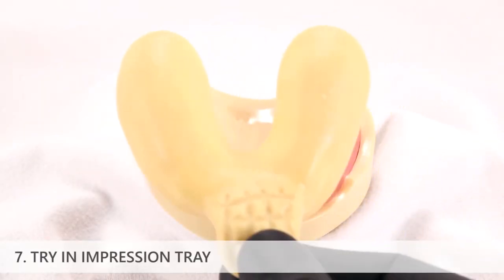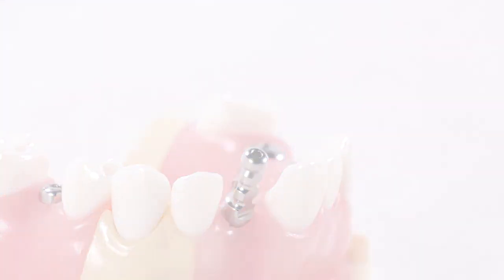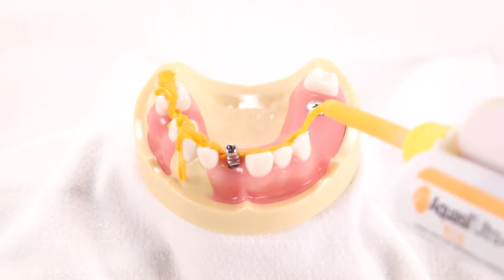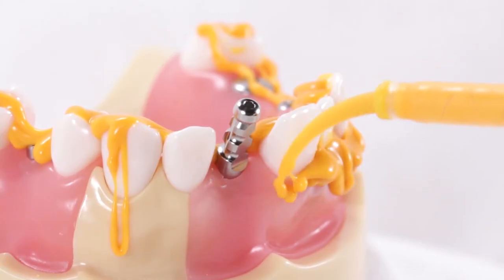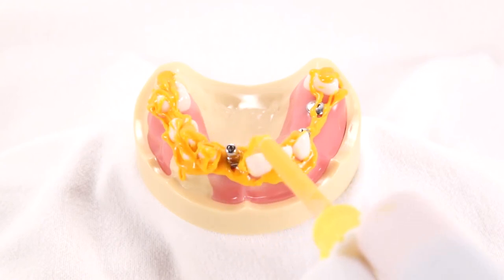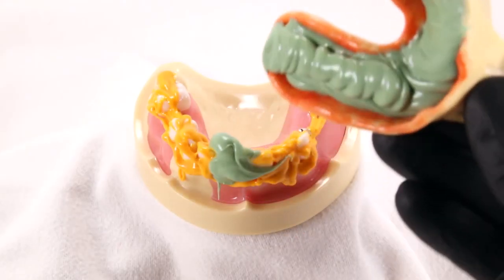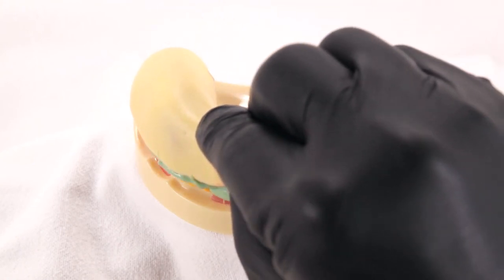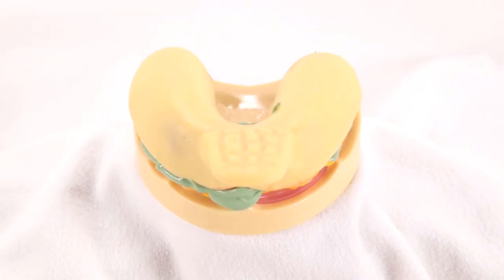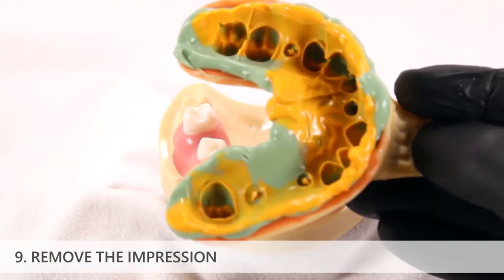Try in the customized impression tray or a rigid stock tray and verify appropriate fit before proceeding. To make the impression, first syringe lightbody impression material on the occlusal surfaces of all the teeth in the arch, then continue with lightbody around the gingival margins and interproximal surfaces of the teeth adjacent to the implant. Syringe heavybody impression material around the implant impression coping and ensure it is fully surrounded. Have an assistant load the impression tray with heavybody impression material and seat the tray intraorally. After the impression material has set, remove the tray from the mouth. The impression coping will remain attached to the implant intraorally.